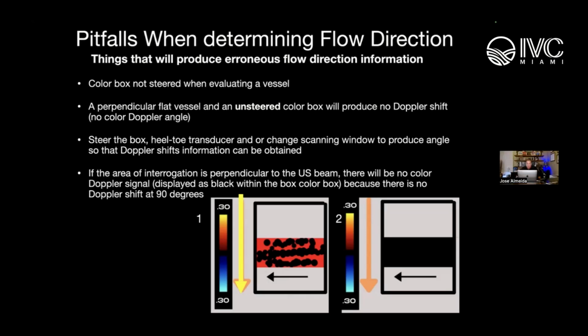So this is color flow. I don't know if you're going to talk about pulse wave Doppler later on, but as you know, with pulse wave Doppler you get a sample volume inside of the blood vessel, and it has to be at an angle. 60 degrees would be the conventional angle because the Doppler equation dictates that sound waves hitting a target perpendicular to flow generate zero, so you won't get any frequency shift.